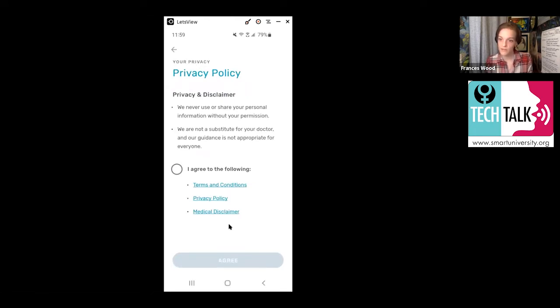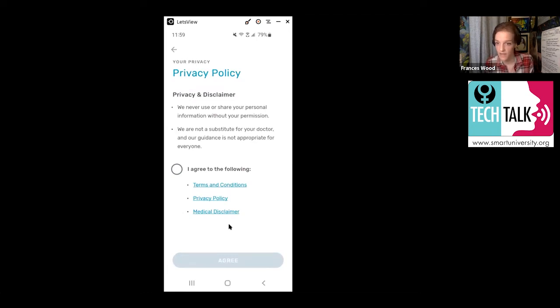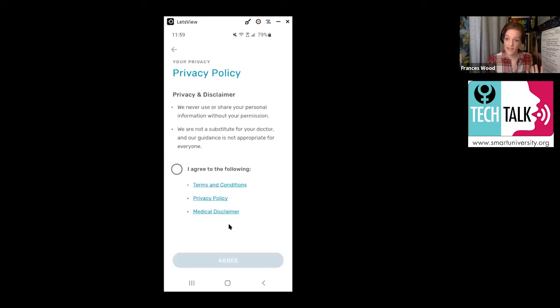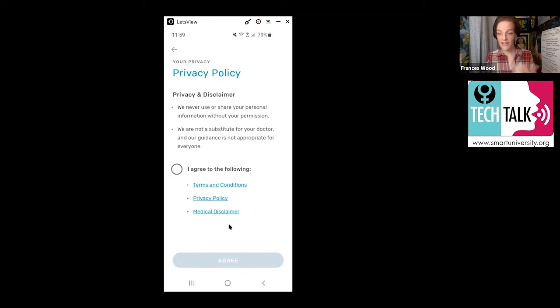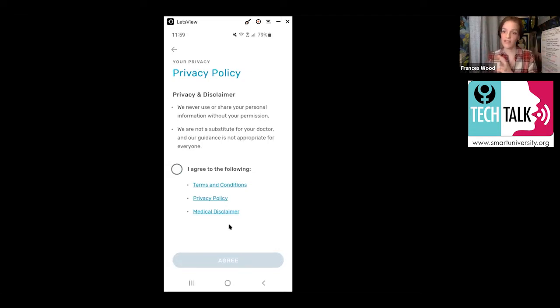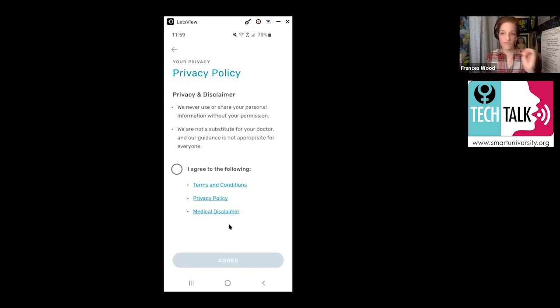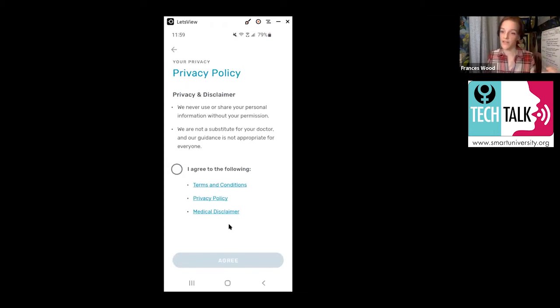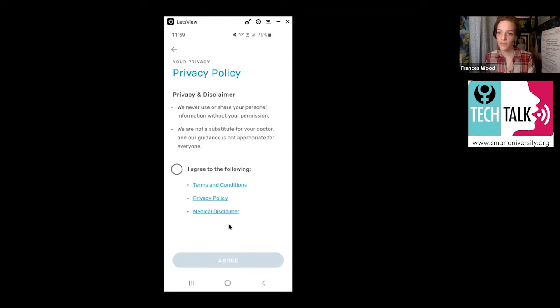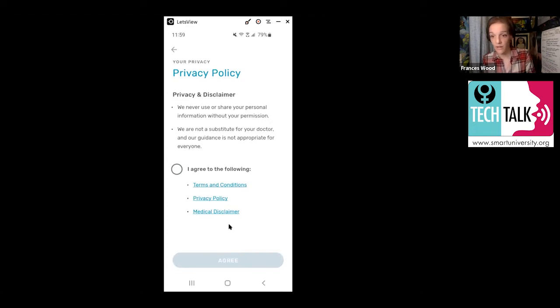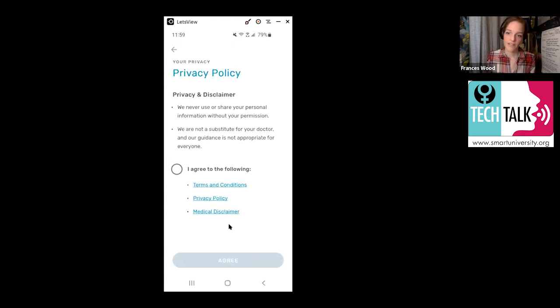This is telling you the privacy policy that goes with the Kinsa app. You can read it if you want to. If you want to look at the terms and conditions, you can do that. But as a brief explanation, what it's saying is that the data they're sharing is not going to be your personal data. The only thing that it will share in those larger maps is that someone from this zip code had a fever of 101.